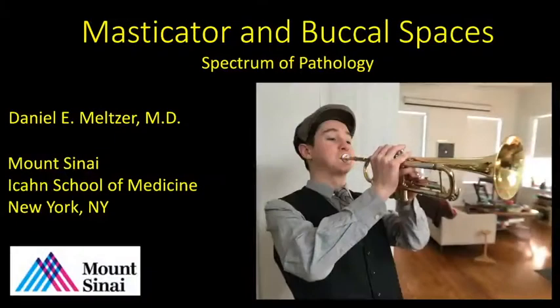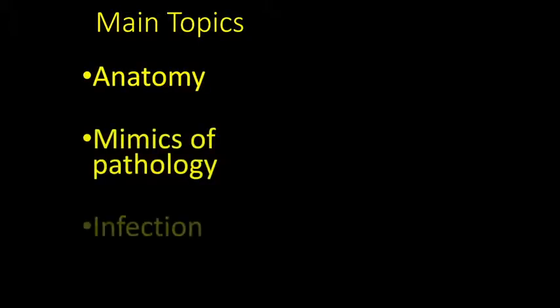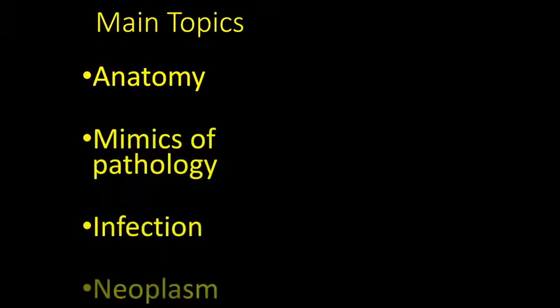Hello, my name is Dan Meltzer. I'm from Mount Sinai Icahn School of Medicine in New York, and I'll be talking about the masticator and buccal spaces. The main topics will be anatomy, mimics of pathology, infection, and neoplasm.